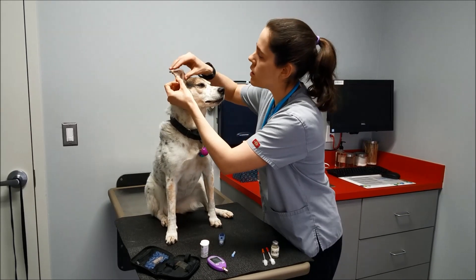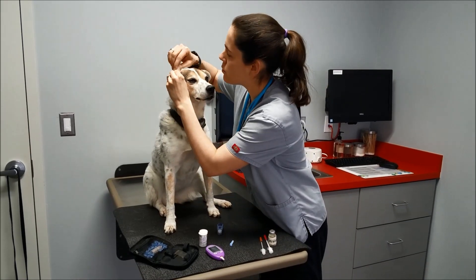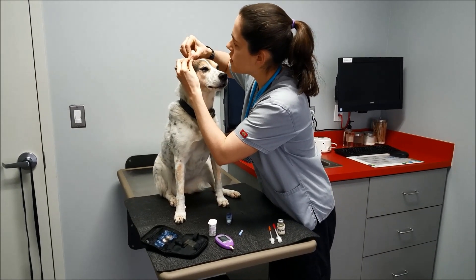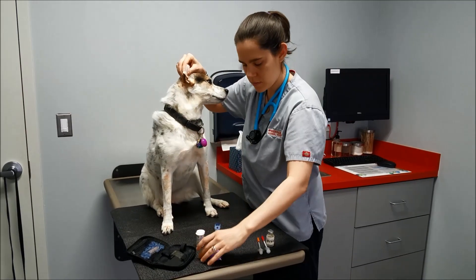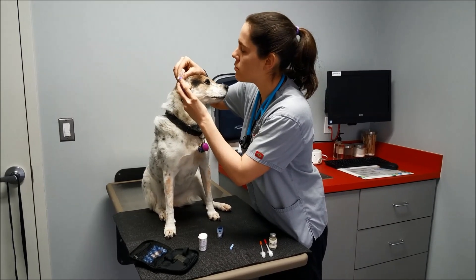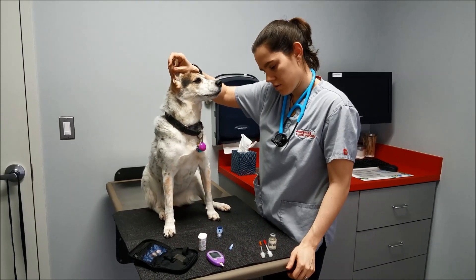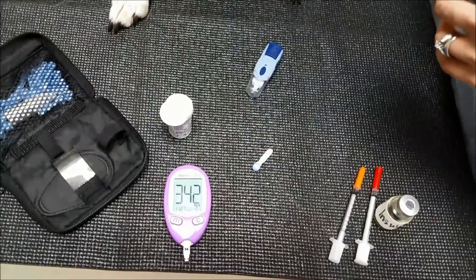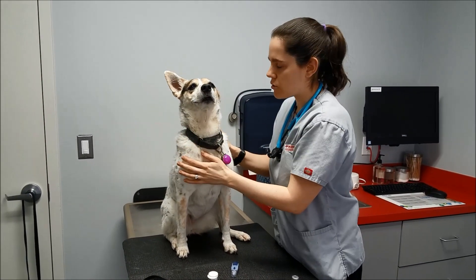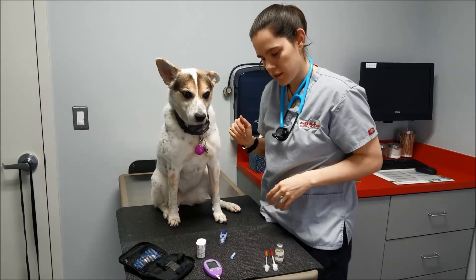So there we are — we've got a little bit of blood flowing here. I'm gonna press in our test strip. Make sure we got plenty of blood for it. Usually it doesn't take a lot, but you want to have a nice droplet right there. And once the screen has the little blood drops on it, you know it's ready to go. Put this next to the blood, it beeps, and then it gives us our reading. So we got 342. We report that to the doctor, and I just like to massage the area we got to, just so that closes up.